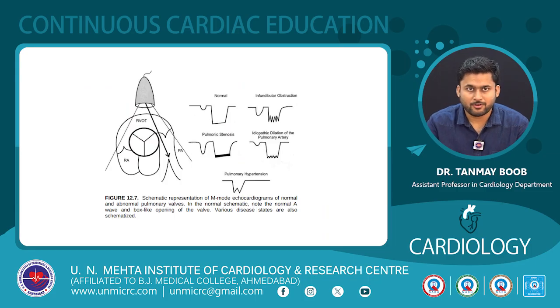This is a demonstration of the modified short axis view at the base of the heart. The probe is directed towards the pulmonary valve and the M mode echo is done cutting through the pulmonary valve. The first image we can see is the normal pulmonary valve, which has two waves. The first wave is the presystolic A wave due to RA contraction, and the second is due to RV contraction.